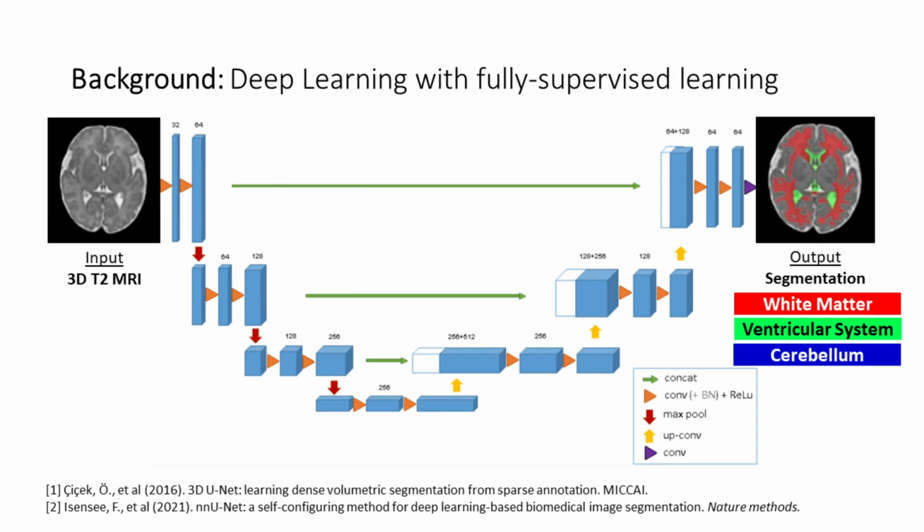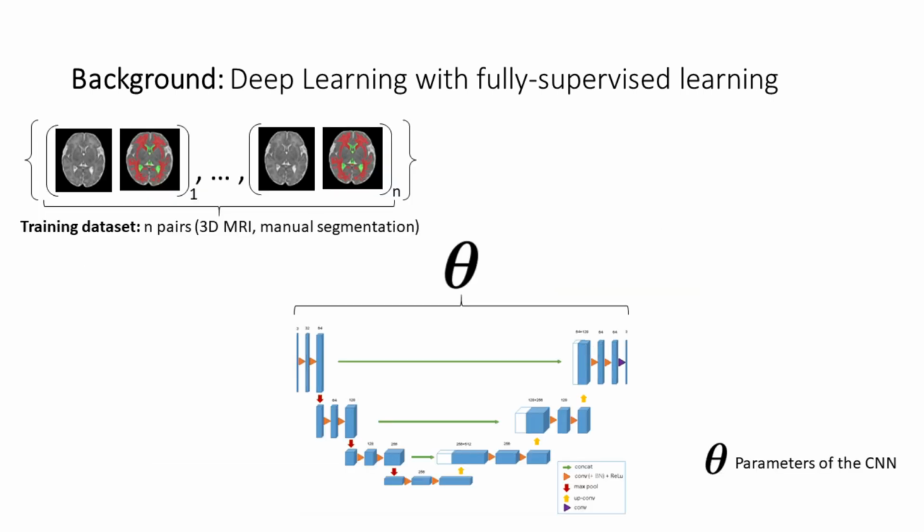The current state of the art for fetal brain segmentation is deep learning, and deep learning needs a lot of manually segmented fetal brain MRI to be trained.